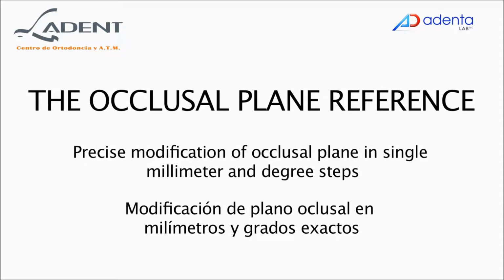The occlusal plane reference allows the exact and predictable correction of setup models, as well as the positioning of labial or lingual brackets for indirect bonding.